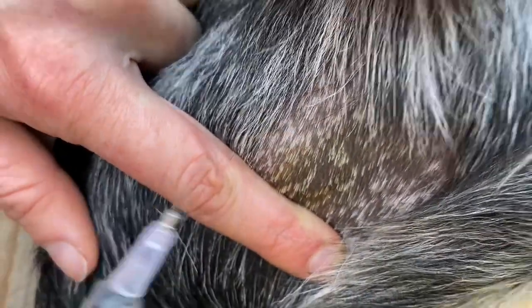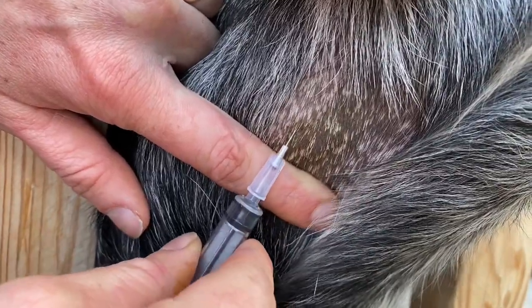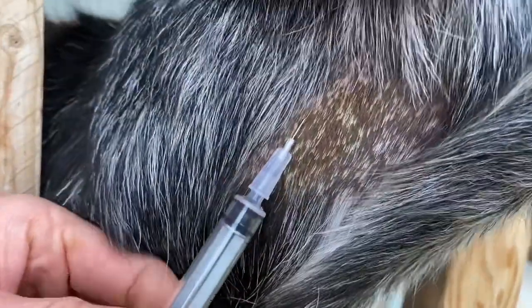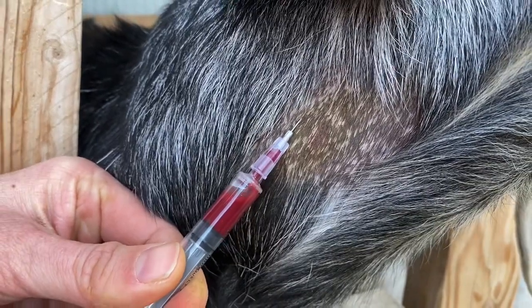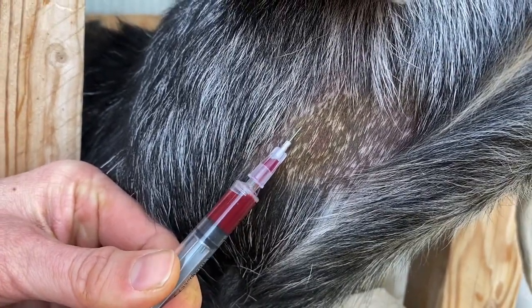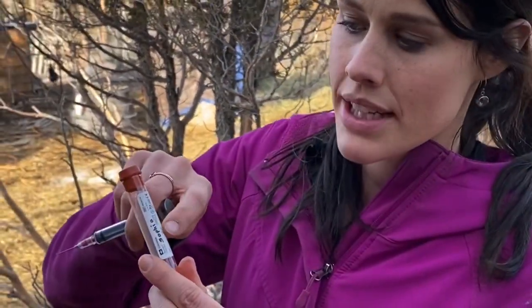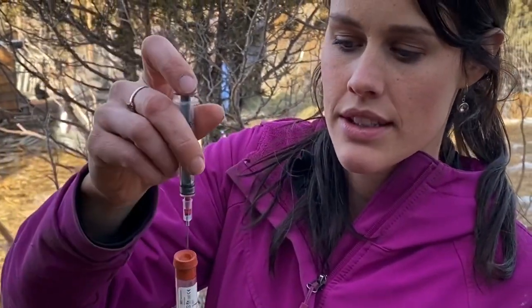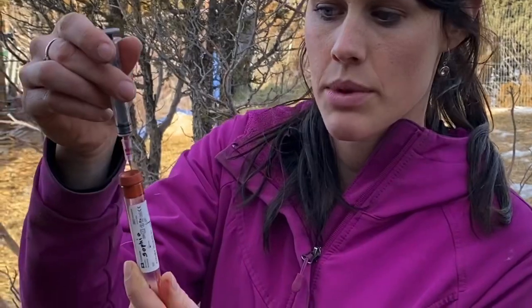I'm just going to go in slightly up, and then you can let go, and if you got the vein it will just start to draw blood. This is a red top tube — it has her name on it. You put the needle in like this and it automatically sucks the blood into the tube, and then when you pull it out it vacuum seals behind the needle.